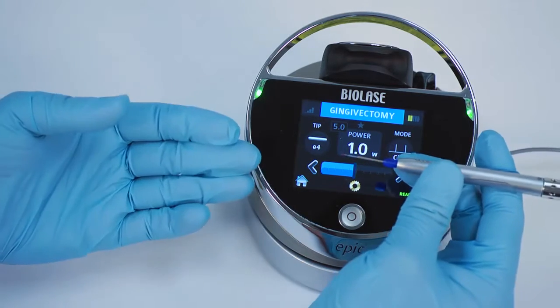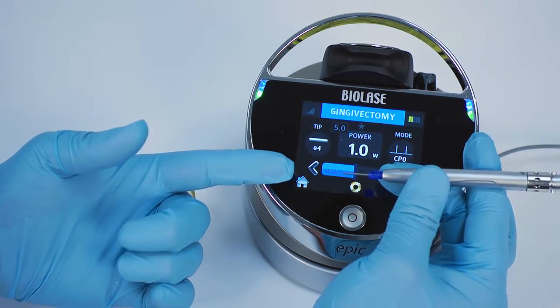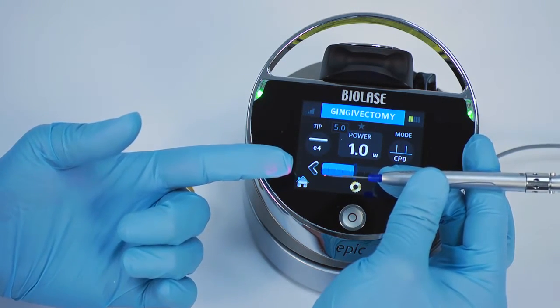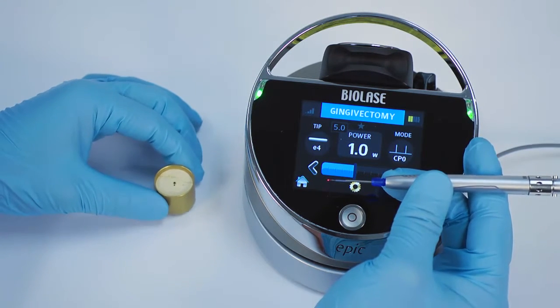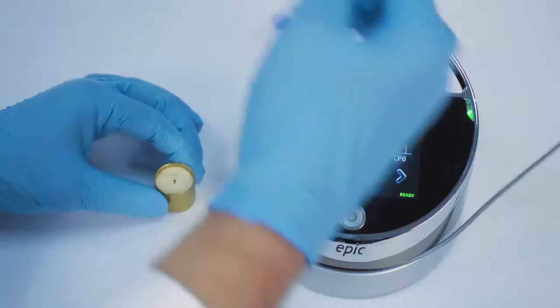Fire the laser quickly at a non-reflective surface once. The tip should glow yellow-orange. During a procedure, there is a chance that the tip might lose its initiation. Repeat the tip initiation procedure if necessary.